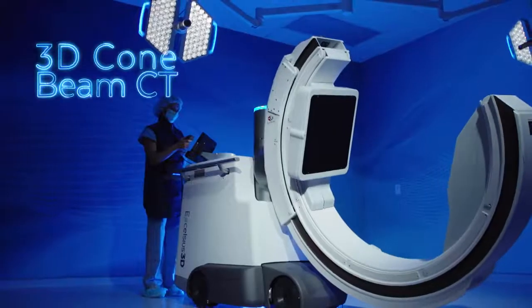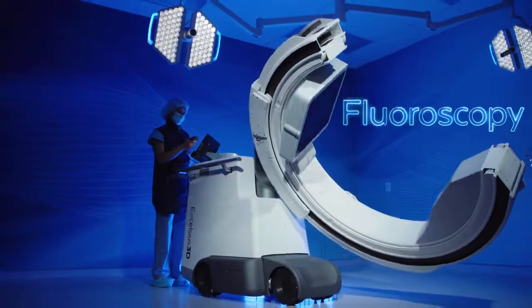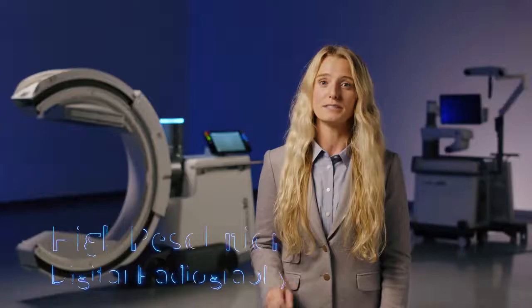Excelsius 3D is a 3-in-1 imaging platform that consolidates 360-degree cone beam CT, fluoroscopy, and high-resolution digital radiography into one unified solution, adapting to all stages of a procedure and eliminating the need for multiple imaging systems.